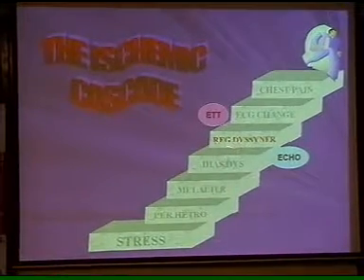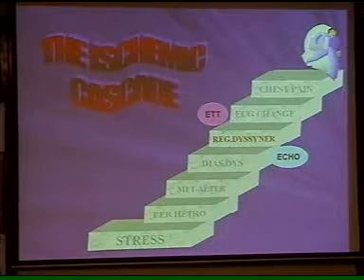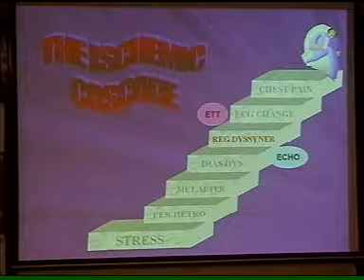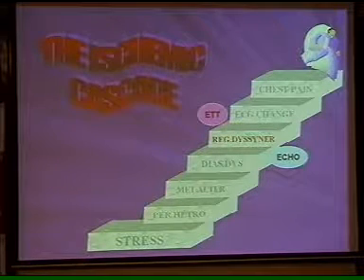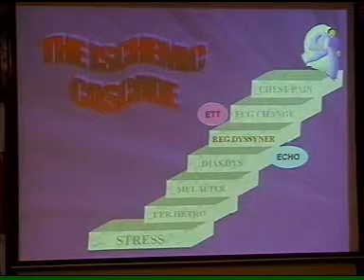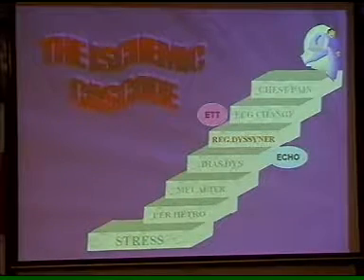There is diastolic dysfunction and regional dysynchrony. So if the patient is in the emergency and the ECG is normal, that does not mean the patient does not have cardiac symptoms. You can suggest echocardiography, and if there is new diastolic dysfunction or any regional wall motion abnormality, that means the patient is having ischemic heart disease.